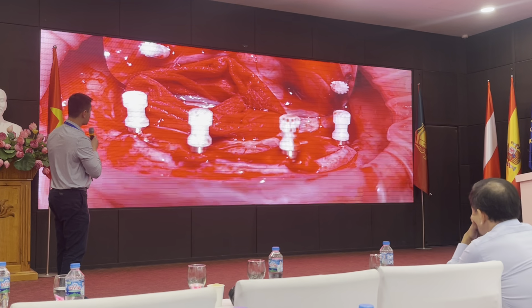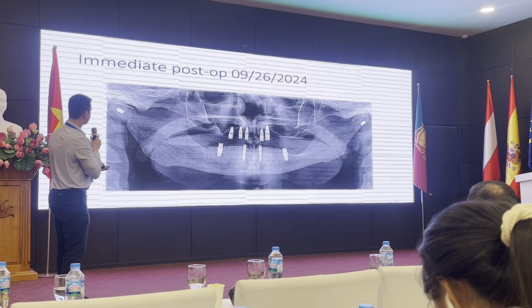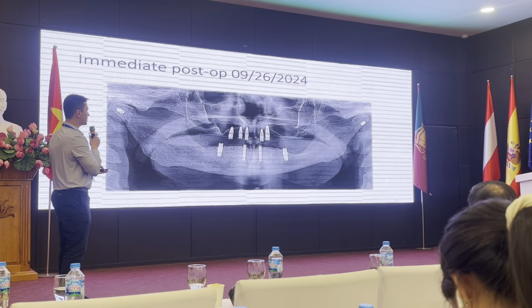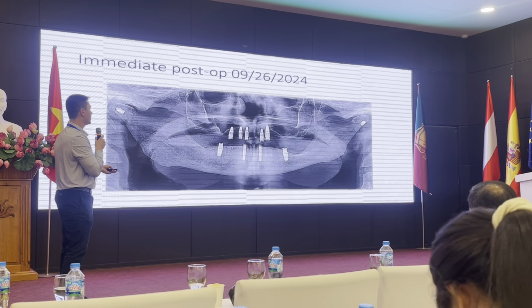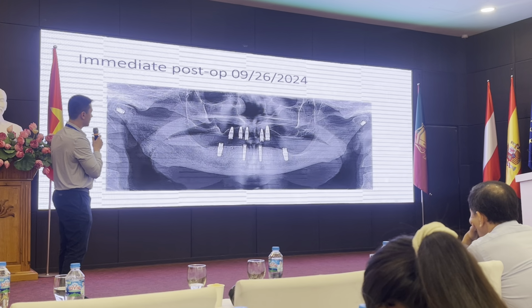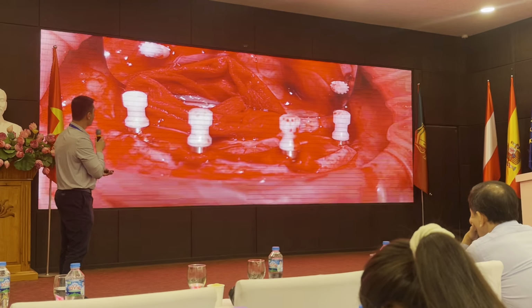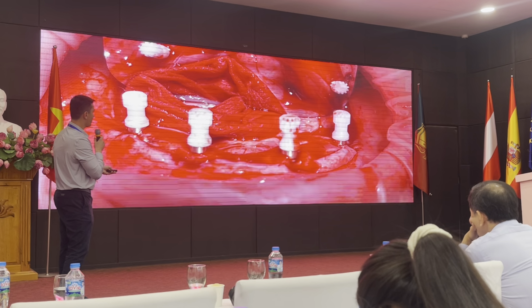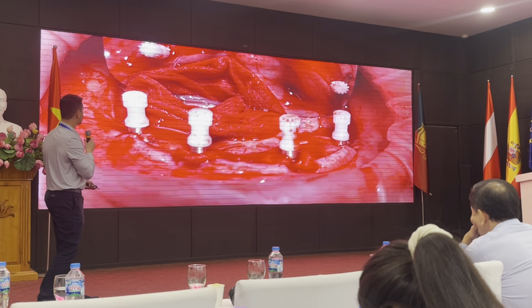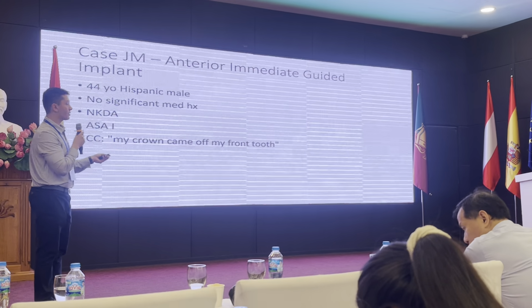These little white caps here are the attachment carriers for these locator abutments. Even though we reduced so much bone, the panoramic looks like we didn't really take anything down, but he's got these lingual tori here, so on the panoramic it looks real tall. But we saw in that photo that everything looks nice and flat right here, over here, and over here. He's got those lingual tori there. That was a fun locator case.